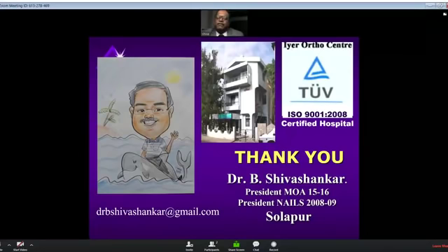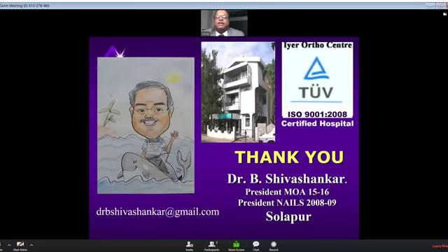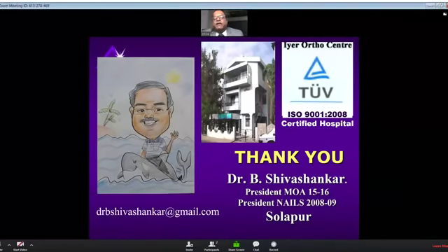The second thing, which I advocate as better, is to take a piriformis fossa entry. With piriformis fossa entry, the problem of the lateral cortex or the softer lateral wall getting reamed doesn't arise. How to get to the piriformis is also very important. You cannot get to the piriformis with the abducted reduced position.